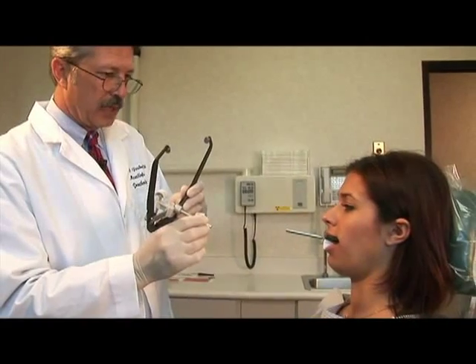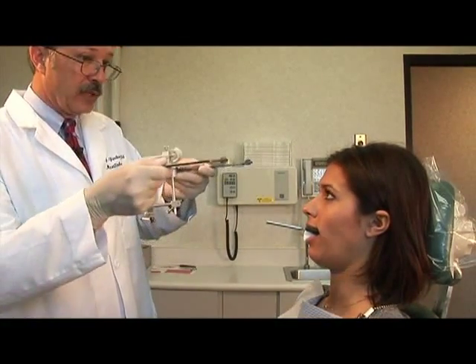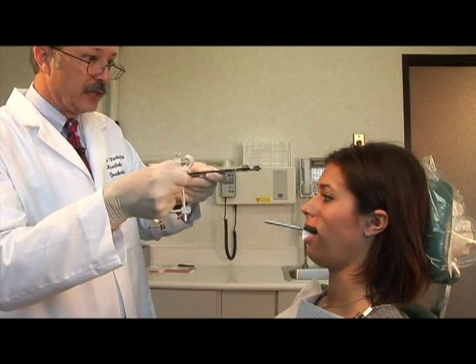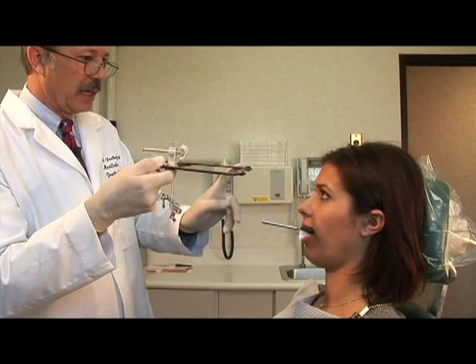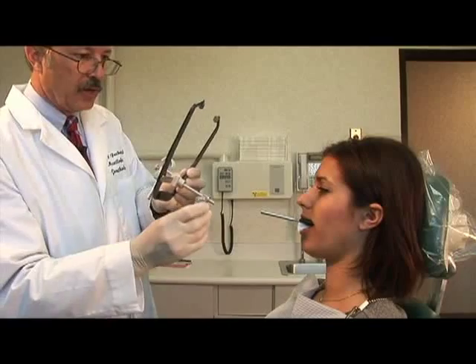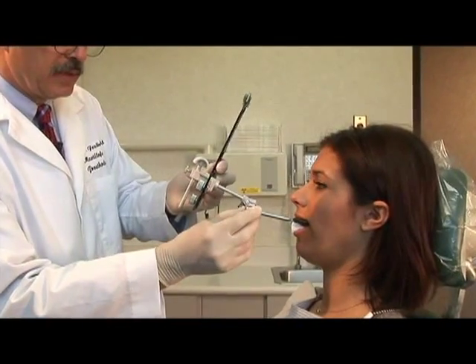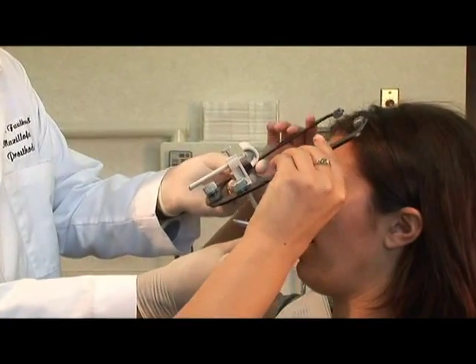What I'm going to do is slide this on the little post that's coming out of your mouth. Once I do that, I want you to reach up, take these and place these in your ears. And I want you to put one finger on either side, just like that, and just hold gently against that. Keep your head in the headrest at all times, please. Okay, go ahead and place those up in your ears.